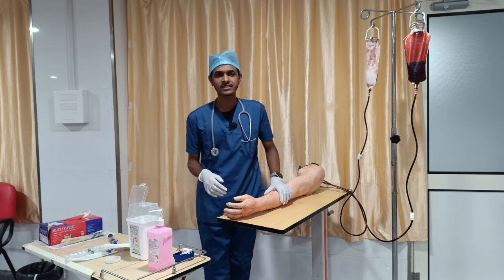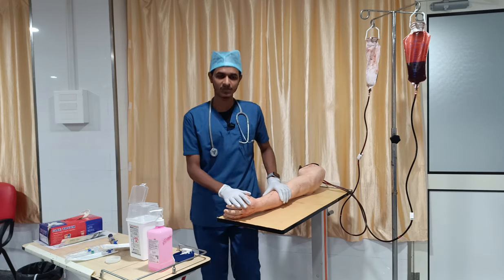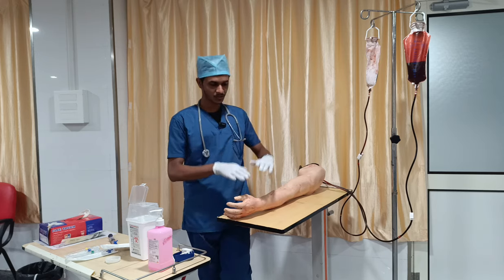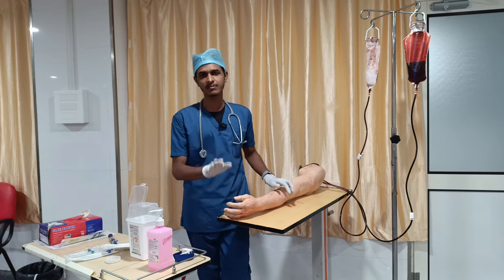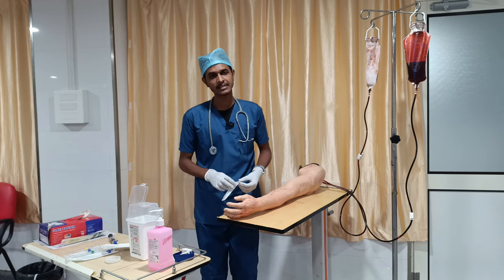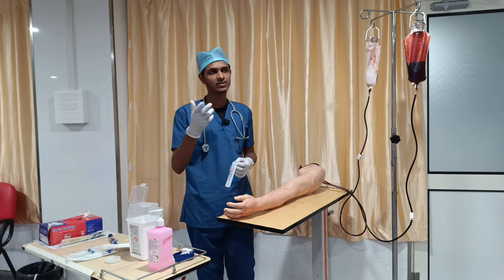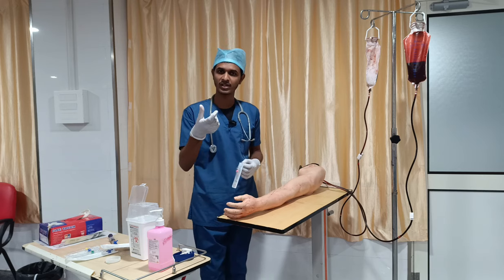Before getting into the procedure, we have to comfort the person and place the person in a comfortable position. At the same time, your comfort is also most important. So if you want to raise the bed, you can raise it, or you can sit in a comfortable position based on your preference. Then we go to the next part, where we are going to insert the cannula. As I told, before inserting the cannula you first have to fix the purpose, for what purpose we are going to insert.